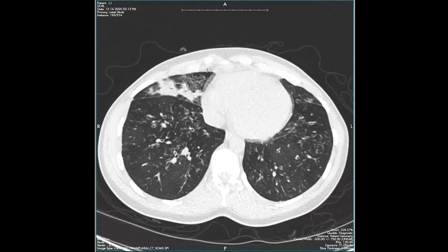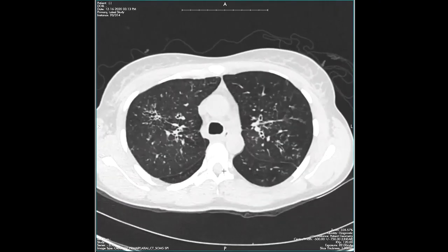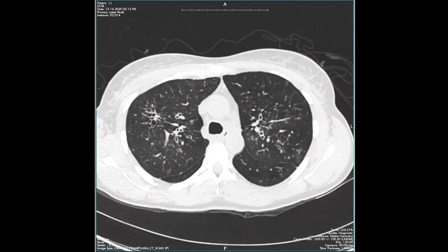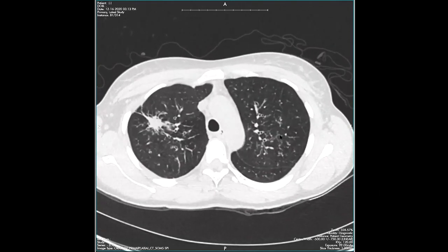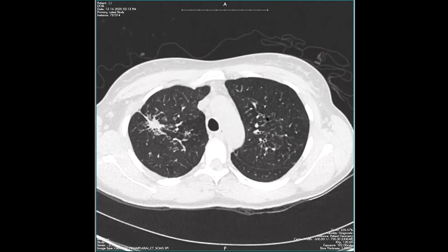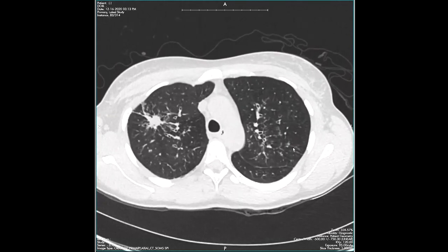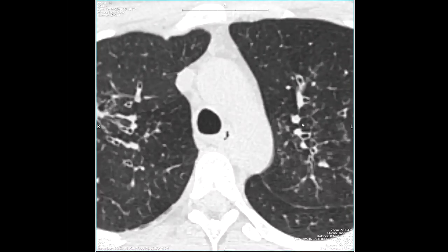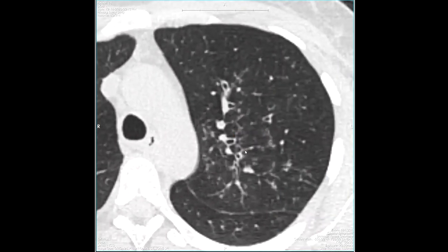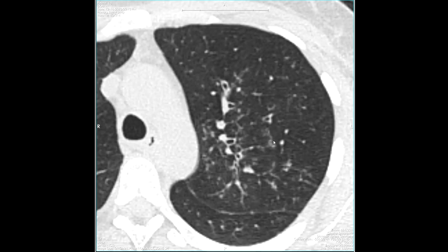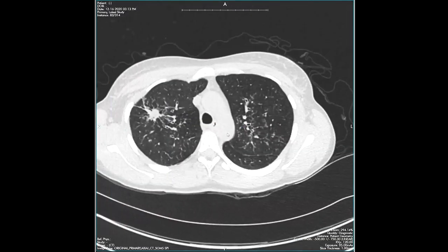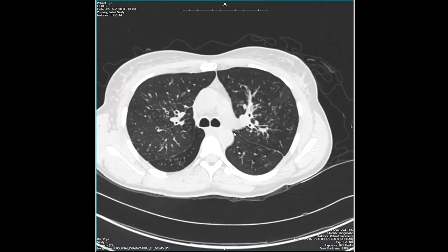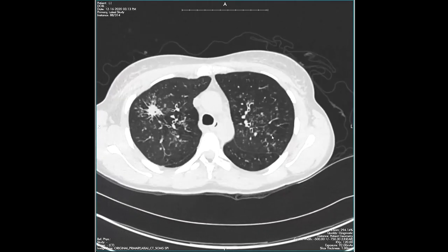Now to distinguish between those two, we have to decide — do we think that the distribution is more diffuse or more clustered? In this case, it's kind of throughout the lung parenchyma, but if we focus on say the right upper lobe, notice how some of these nodules are really just in some areas, while there are areas up here that are largely spared. Now zooming in to this area, what we're actually seeing is a septum, and then we're seeing little tiny nodules studding along the septa, creating a line. When we see lines of nodules, that should make us think of a perilymphatic process. So now we're seeing nodules along the fissural and pleural surfaces, and seeing lines of nodules — again, telling us it's perilymphatic.